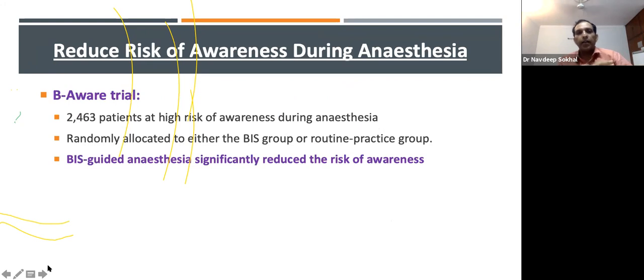The B-Aware trial, which you must all be aware of, was a large trial using 2,463 patients at high risk of awareness during anesthesia, and they were randomly allocated to either the BIS group or routine practice. And BIS-guided anesthesia significantly reduced the risk of awareness. This was the result of this study.